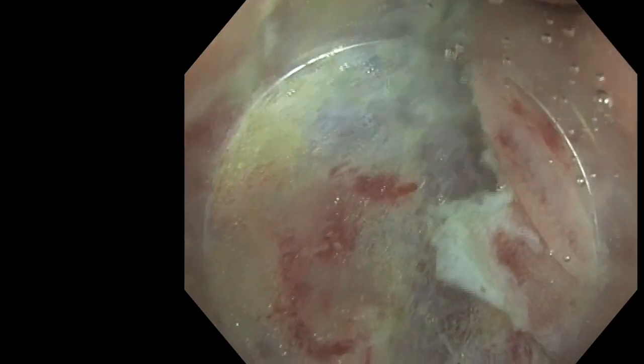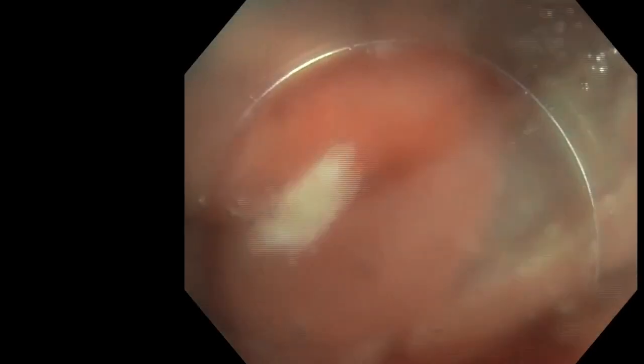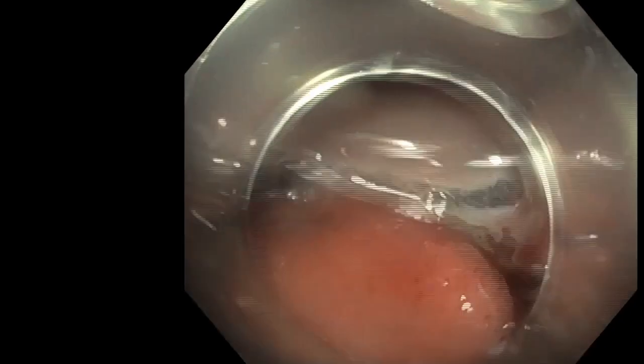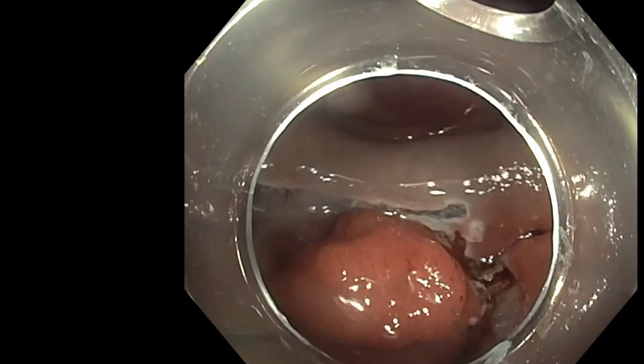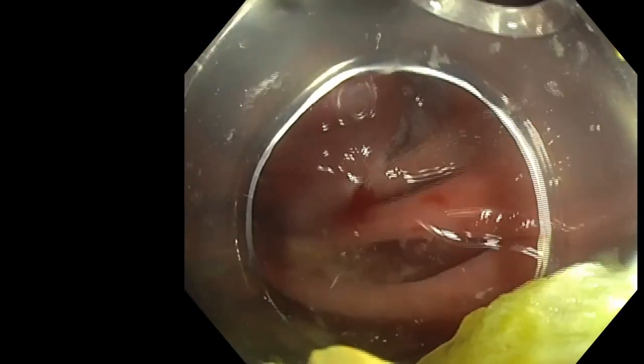And as soon as we see that the space is large enough, we will change for a pediatric transnasal forceps, rat-tooth forceps, but transnasal one, in order to insert the attract device, the multipolar adaptive traction device, into the channel in order to fix the traction.